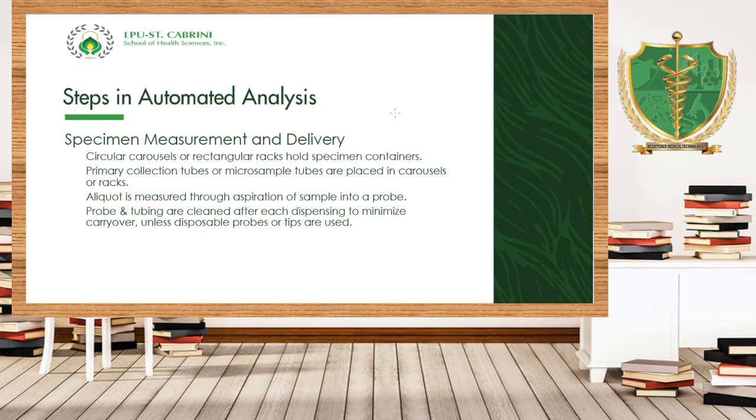Okay? Next is probe and tubing are cleaned after each dispensing to minimize the carryover. The reason why, if you see in your machine or on the display screen of your machine na nakalagay doon rinsing, ibig sabihin, nagke-cleanse siya or naglilinis po siya ng kanyang probe, no? Para po ma-eliminate ang ating carryover.